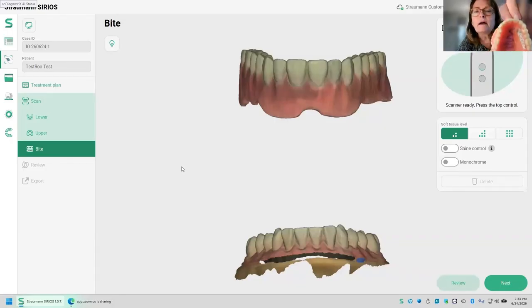I will share. So I don't know how well you can see it. I can see it. Perfect. Yeah, absolutely. So it is a barrier material. You can get it on Amazon, and then it has a light cure to it. Used it today, and it worked really beautifully. Oh, no kidding. An actual curable material on the palate. Yeah, so it's truly three-dimensional. And you can just flick it right off. It doesn't stick, so you flick it off. Nice. What's that material called again? It's called gingival barrier. Nice. And I ordered it from Amazon. Got it. Good tip.